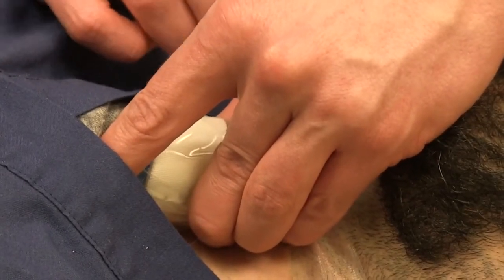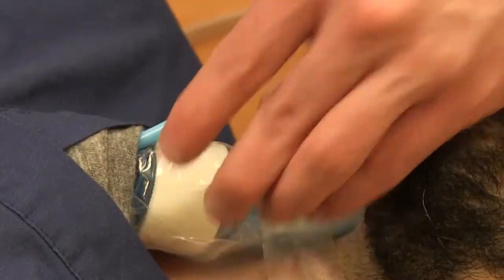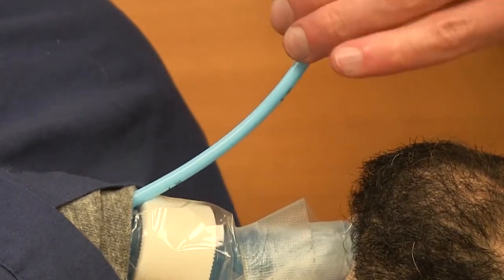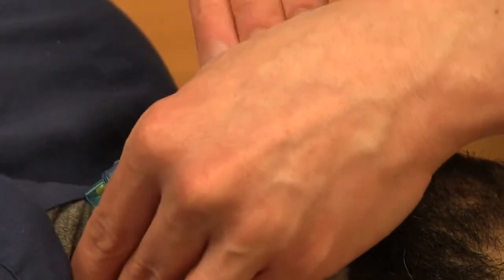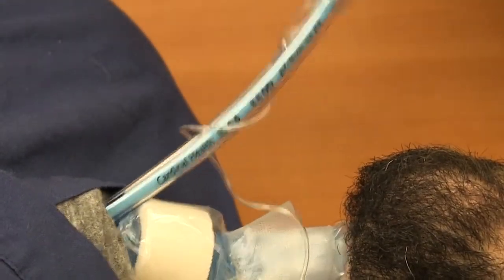I slowly and gently advance until I reach holdup. At that point, I grab the bougie, place a 6.5 ET tube on top, and railroad with a twisting motion — just until the cuff passes. Then the bougie comes out.